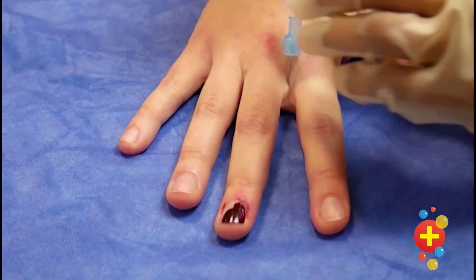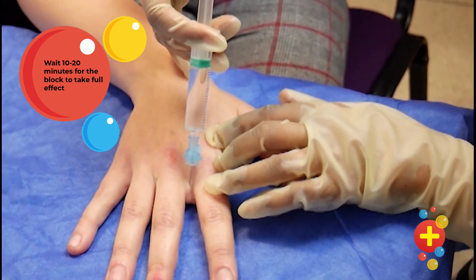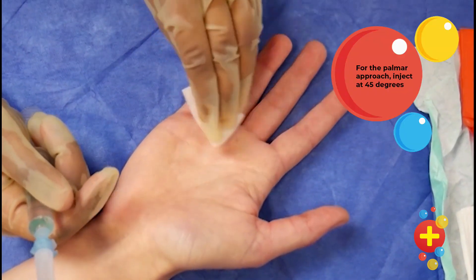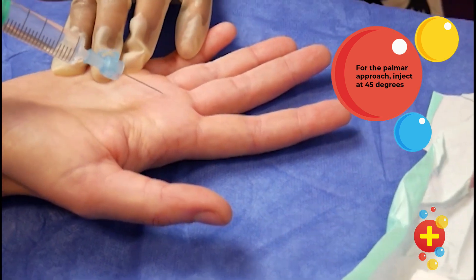Remember, for both approaches you'll need to wait 10 to 20 minutes for the block to take full effect. With the palmar approach, clean the area and then inject using the needle at 45 degrees. You want to make sure that you're not feeling much resistance as you inject, so that you know you're in the flexor tendon sheath and not the flexor tendon itself.